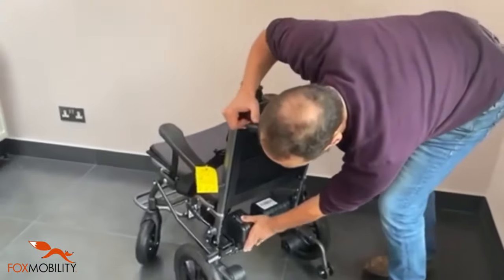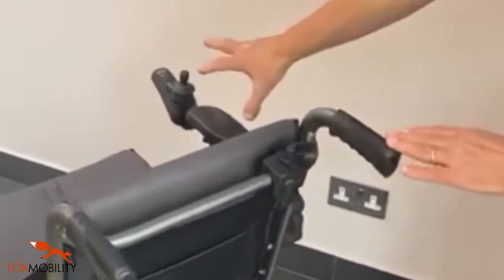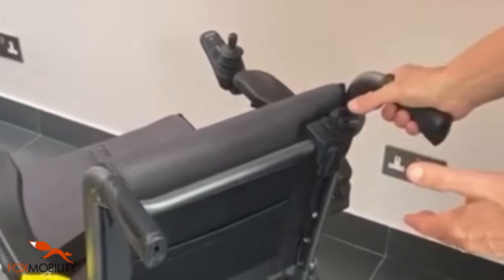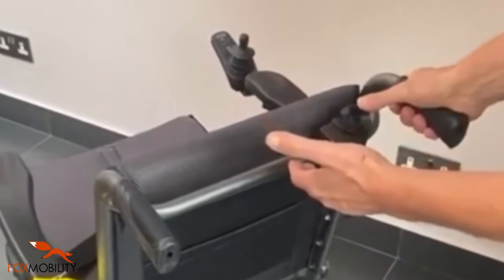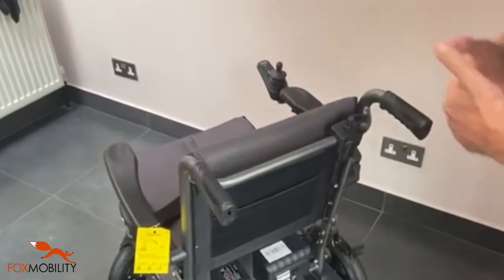One of the nicest features of the product is that as well as having the controller at the front, you've got an attendant control that can very easily take over, and that comes as standard — so literally by pushing forwards you'll be able to control the chair as a carer.